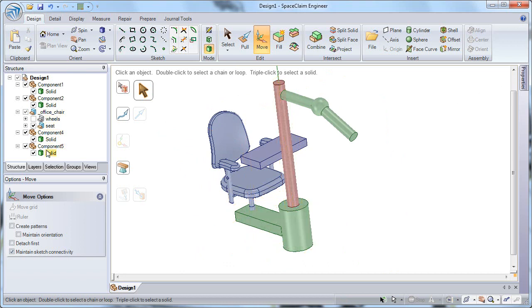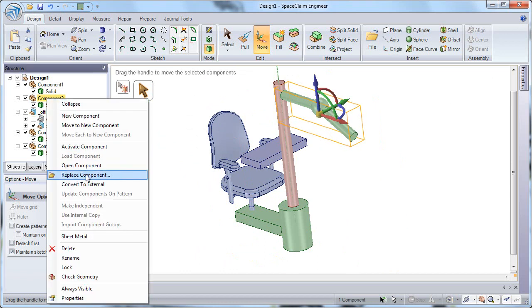I'd also like to replace my arm on the right hand side of this design. So let's right click and replace component again.